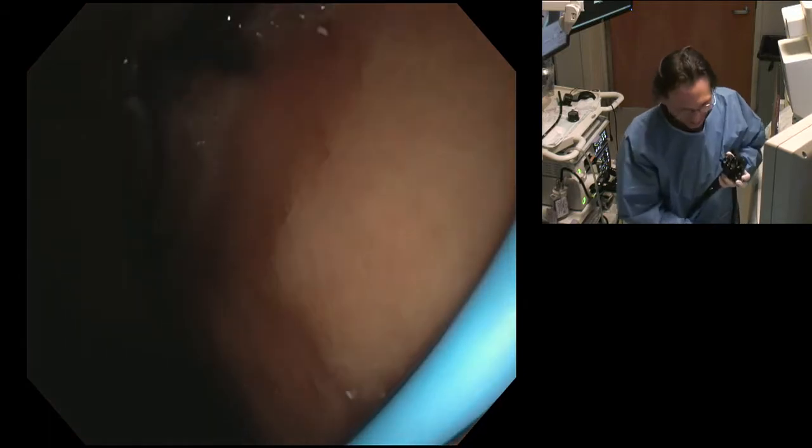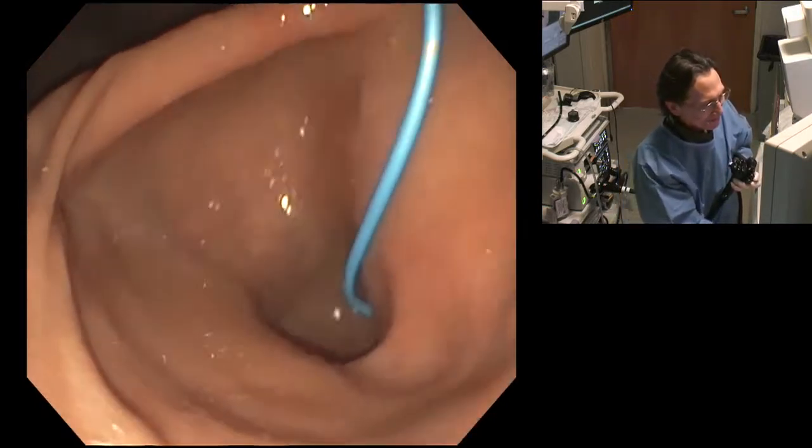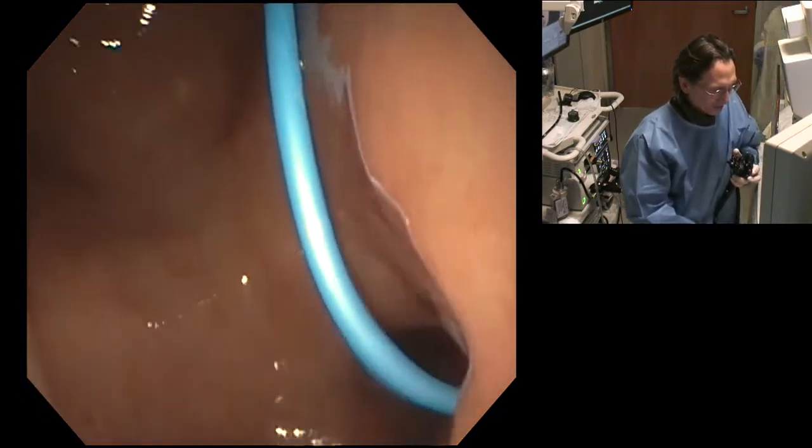Our nurse is holding the nasal cystic catheter in place. It's technically a nasobiliary catheter, and there's certainly no cyst. We're not really in the bile duct. So what do we call this? The nasoluminal catheter would be the proper name. But on the package insert, of course, it's a nasobiliary catheter. That's what this was designed for.